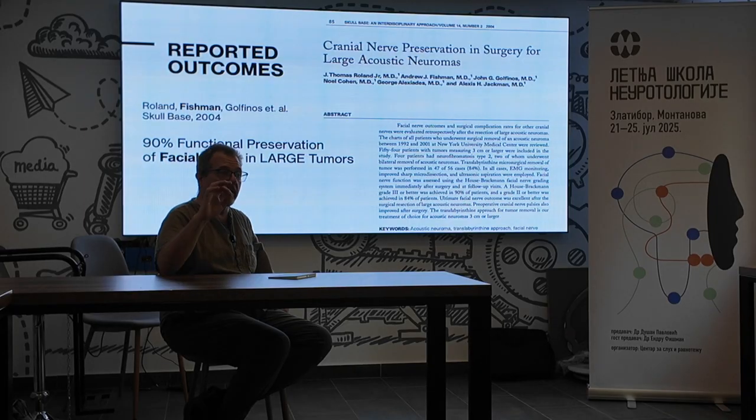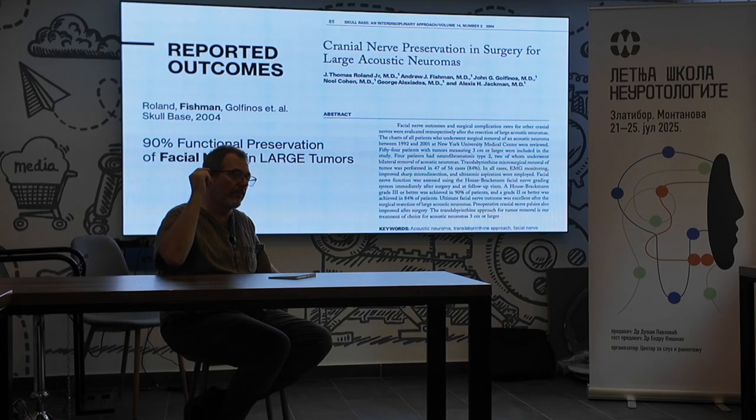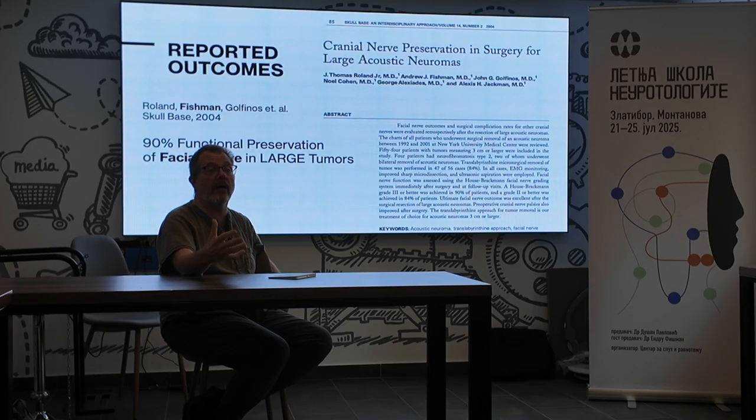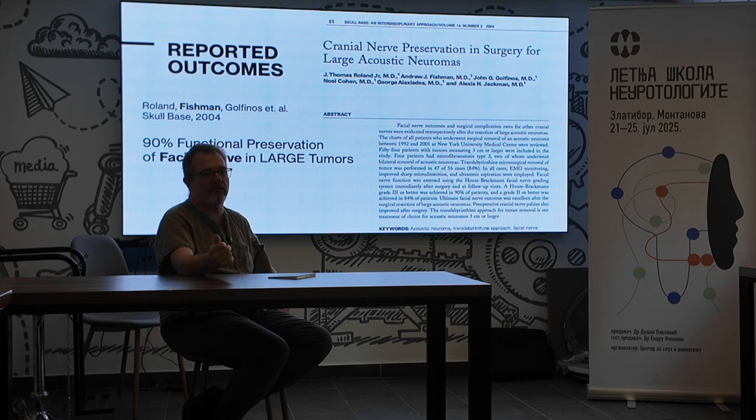And we're doing it by first putting in a temporary electrode, and checking afterwards to see if there's an electrical signal. So you can do a promontory stimulation with electricity to see if you can get some patient hearing, clinical hearing, or some ABR. And we're now developing all of this testing in the OR to check that it's worth putting in this implant. But if we put in a temporary implant, the electrode is okay. It's a small piece of silicone. It can stay. It doesn't have to be removed.